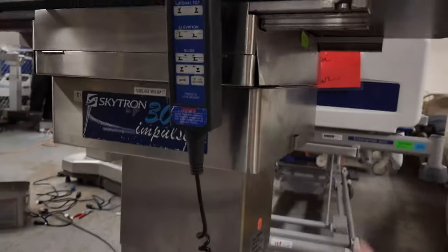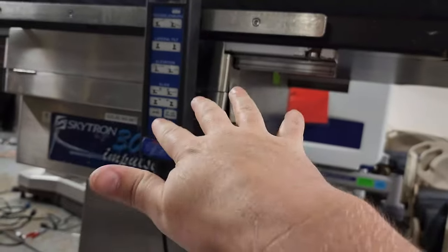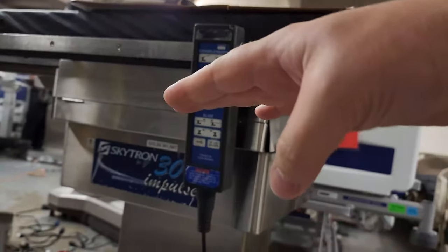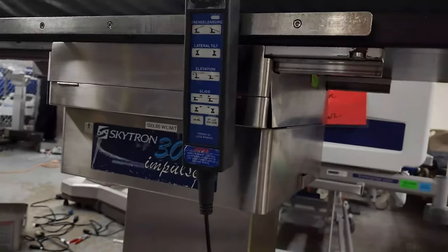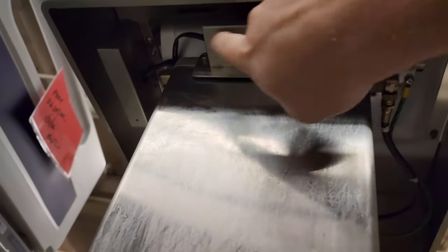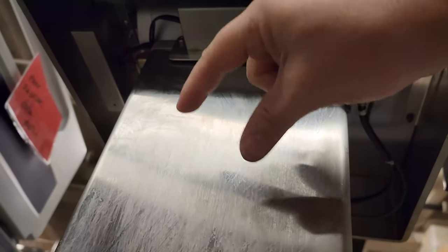When we were doing our final checkouts on this table, one of the things I noticed is that the tilt was not calibrated whatsoever — it was going towards the head and also tilting to the side. These older tables are all calibrated on the axis with micro switches. There's an eccentric cam and the micro switches activate for left and right on the sides of the cam.